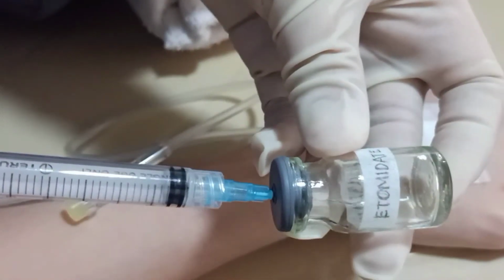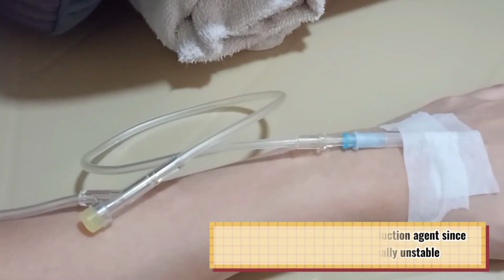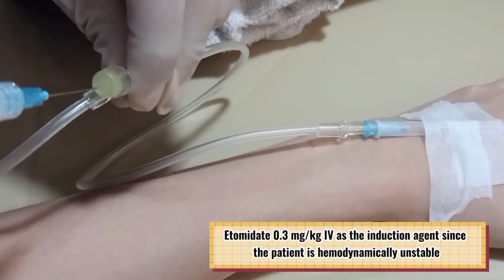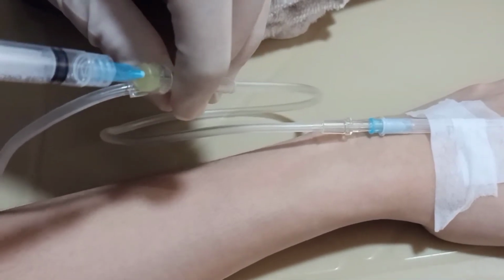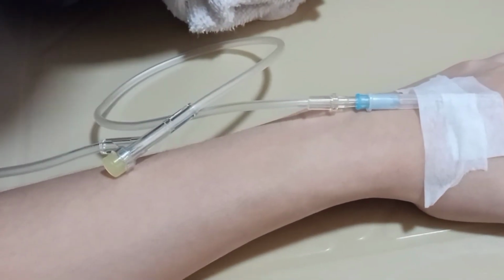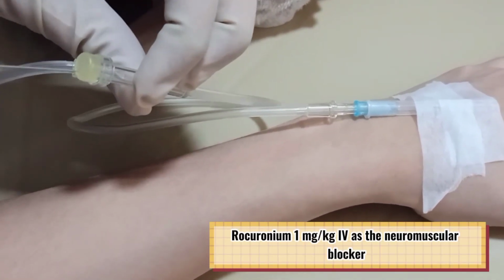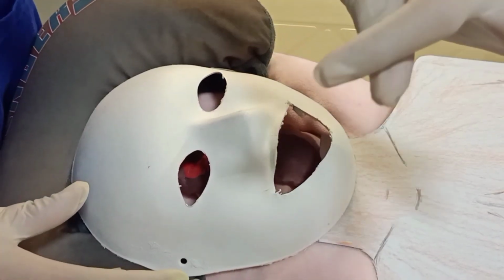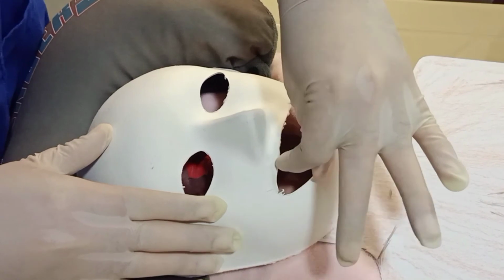Then we can now give the drugs. Administer etomidate 0.3 mg per kilogram IV push to produce loss of consciousness. Then administer the neuromuscular blocker rocuronium at 1 mg per kilogram IV. Now to start the intubation, open the mouth with a scissors technique.